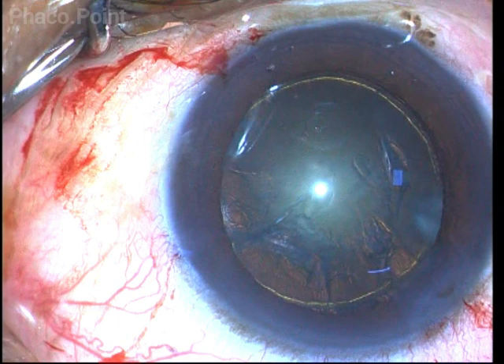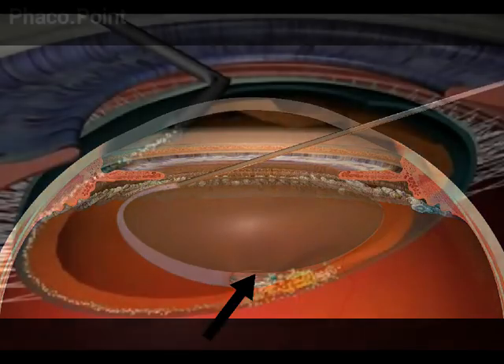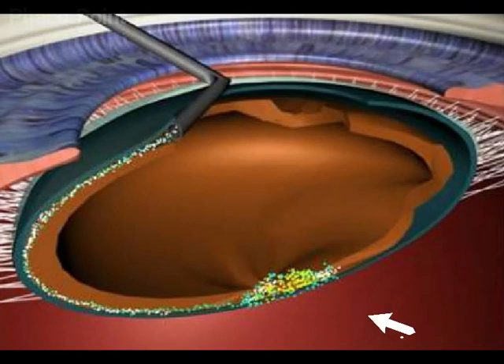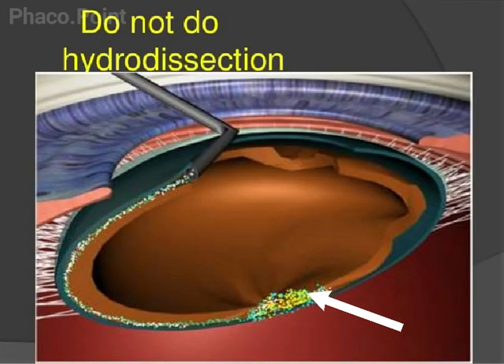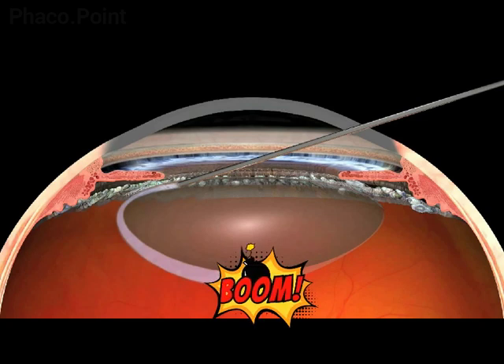It is important to remember that we should avoid performing cortical cleavage hydrodissection, because there is a dense adhesion that exists between the polar cataract and the posterior capsule, which is also slightly thin overlying this area. A cortical cleavage hydrodissection may actually end up splitting the posterior capsule.